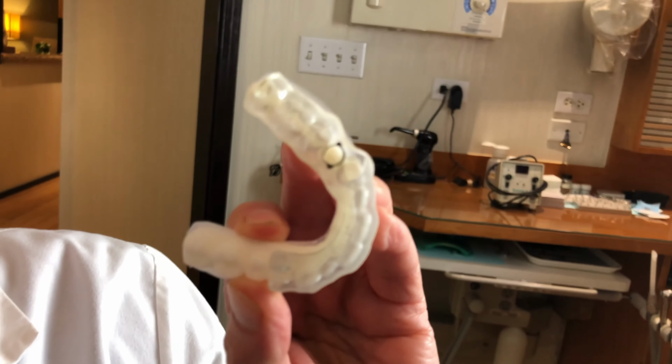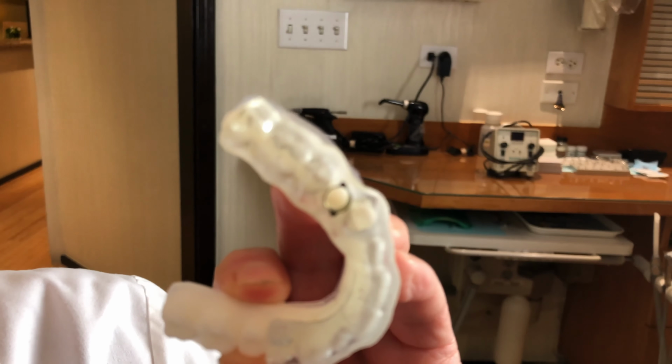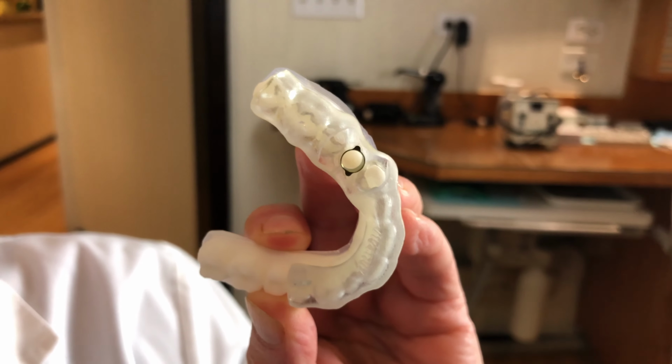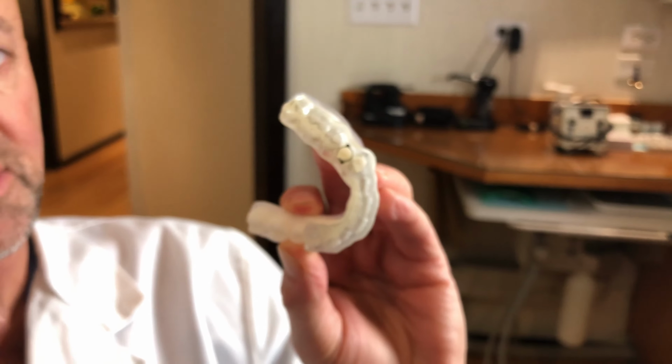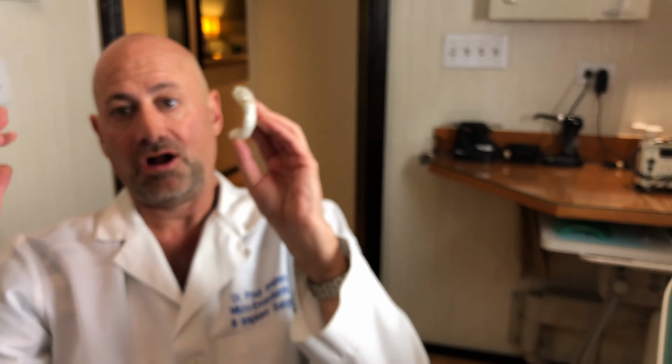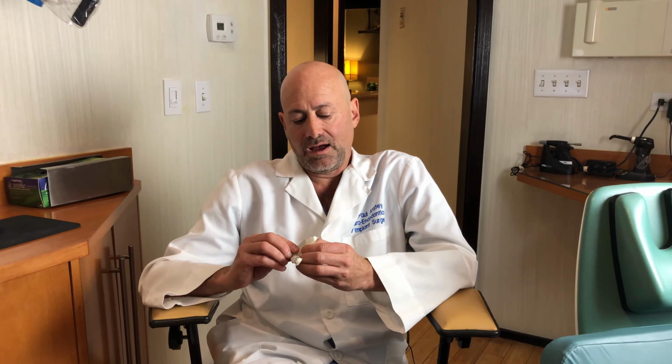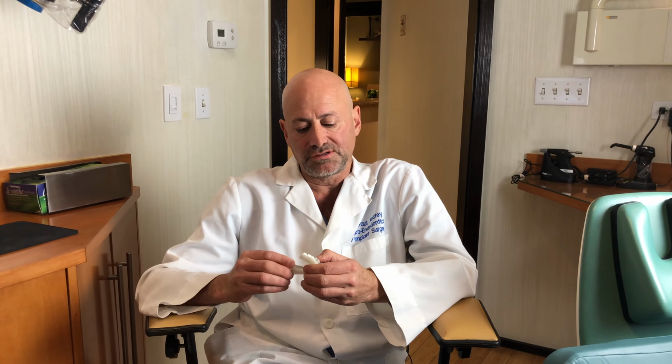When we're placing the dental implant, the implant is going to be guided and the drilling set's going to be guided in the exact dimensions as we planned it on the software that I just explained. So it's an incredible technology, this implant guided software that we use.